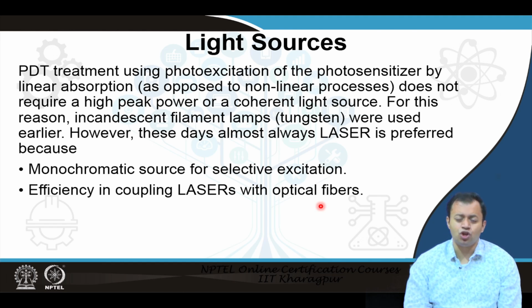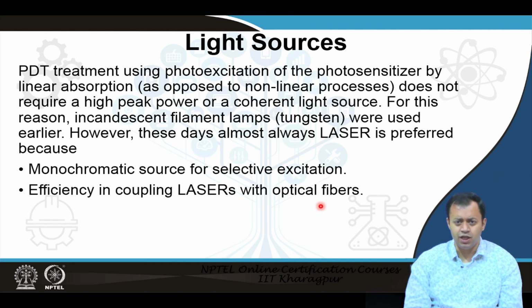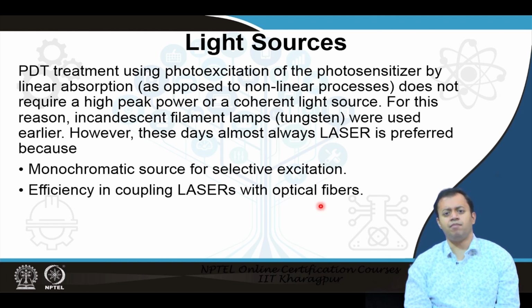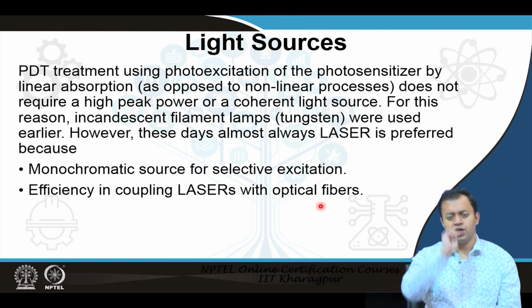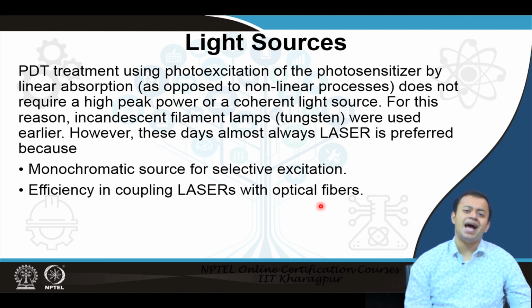A bunch of optical fibers are combined together in very thin tubes, a few micrometers in diameter each. The entire thing is less than a few millimeters in diameter, and it is put inside either through keyhole surgery or through an orifice.